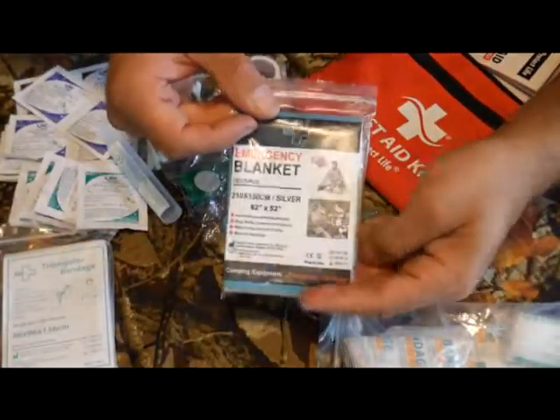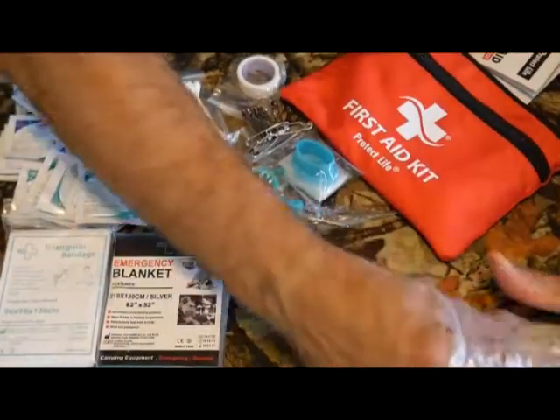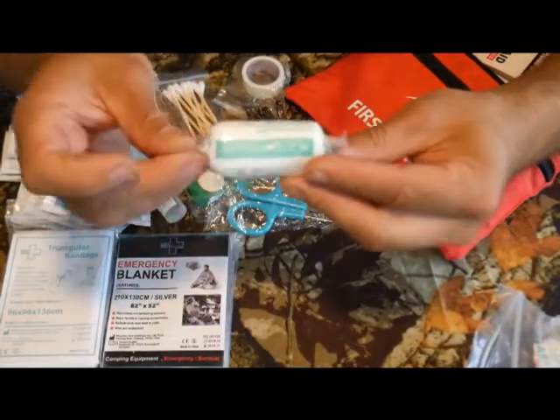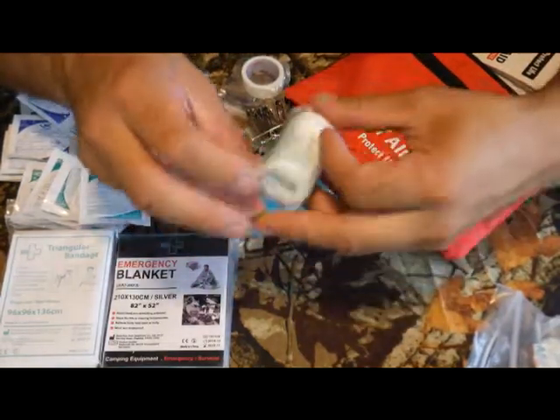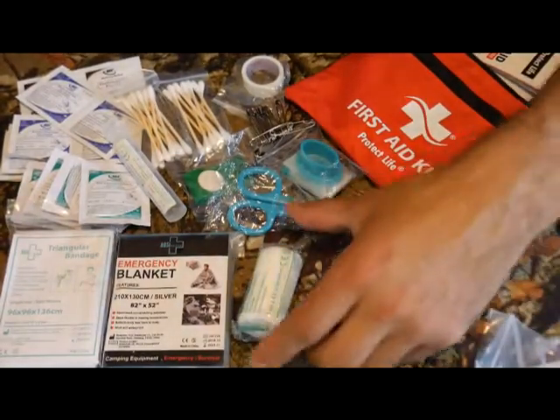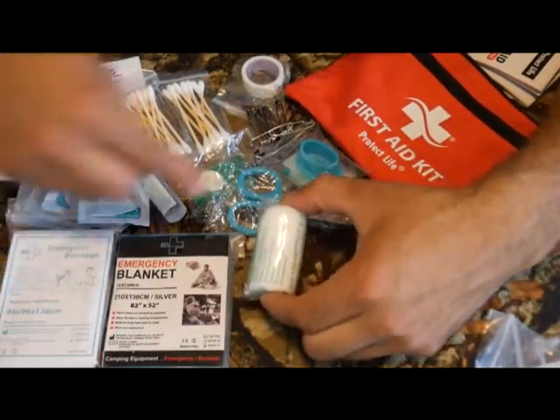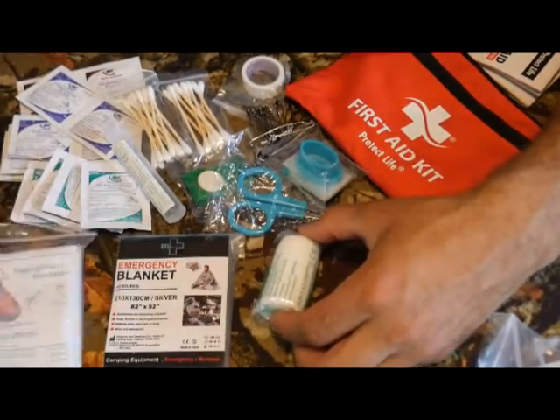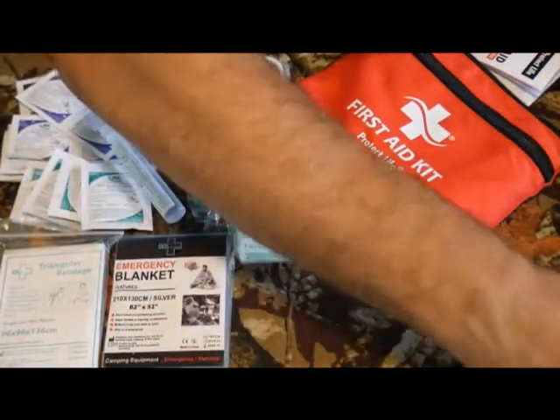Emergency blankets — everybody should have one in their first aid kit to help treat shock, and they're very important for survival use as well. Then there's an elastic bandage roll — it's not an ace bandage, just rolled gauze. If I had to choose, I'd swap this for a small self-gripping ace bandage without metal clips. That's the main thing so far I would swap out of this kit.